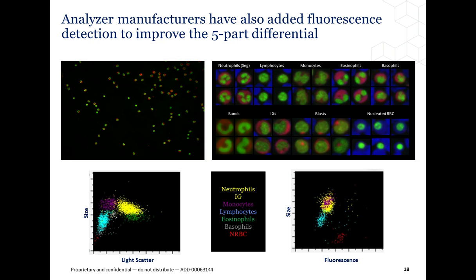These characteristics are determined using an optical to electronic conversion system that records how the cell scattered incident light and emits fluorescence. Take a look at the upper left image. At low resolution, these are what the stained nucleated cells look like. The upper right image is a high resolution image of the categorized fluorescent positive nucleic cells cellular events. And you can see clearly something that looks very similar to when we look at a microscopic evaluation of a Wright stained smear. In this case, obviously, we're seeing one color of fluorescence.